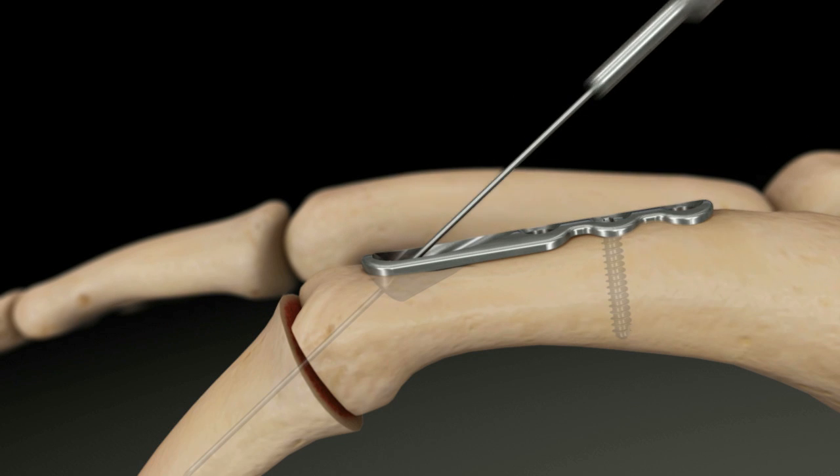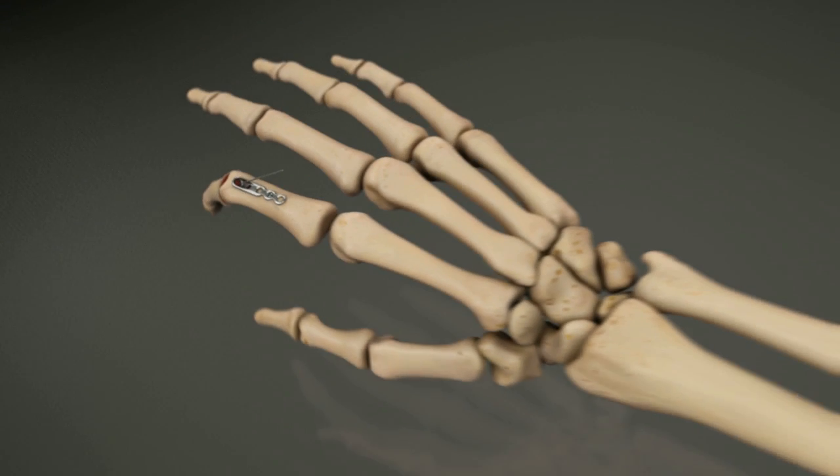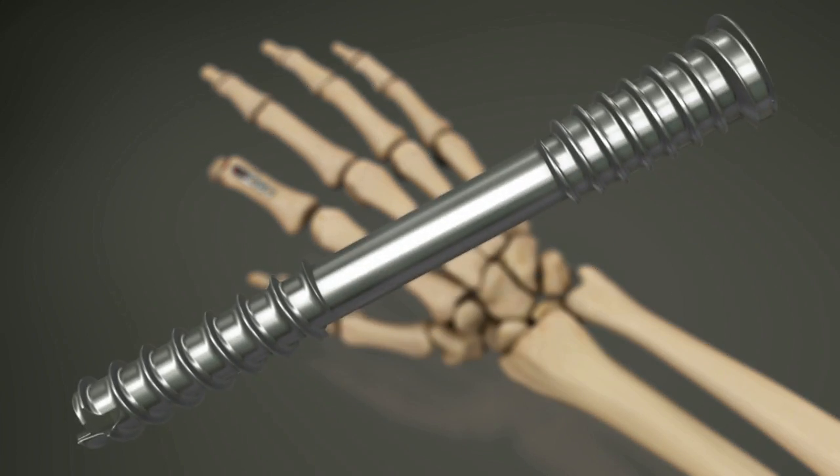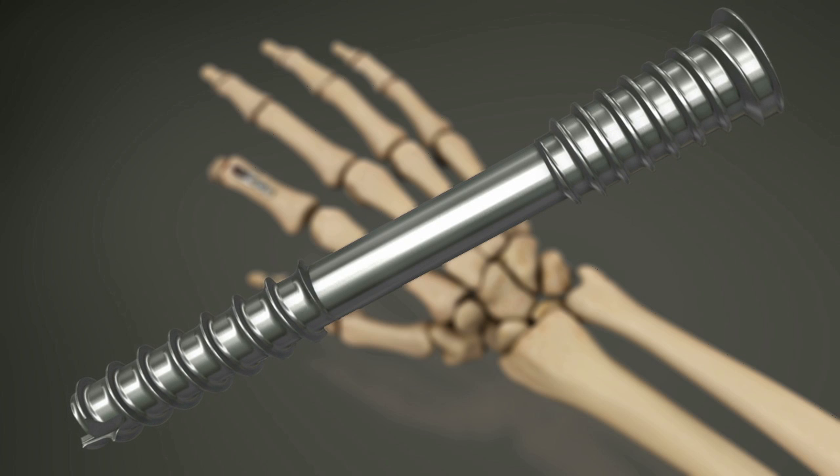Reference the length measured and place the appropriate fusion screw. This screw is cannulated and will lock into the plate when fully tightened.